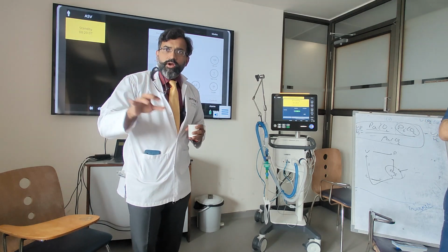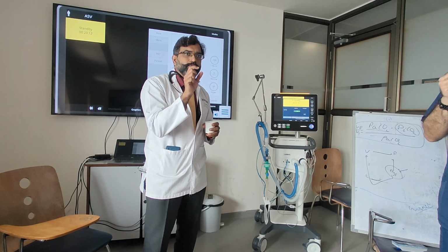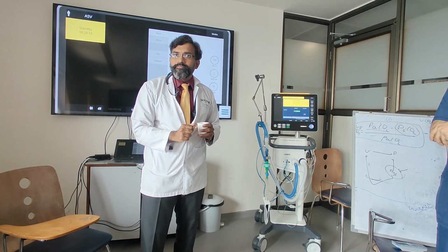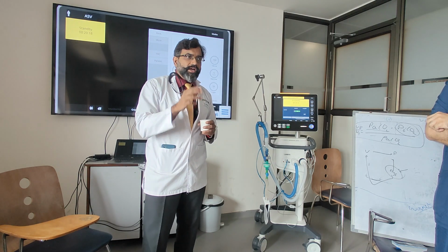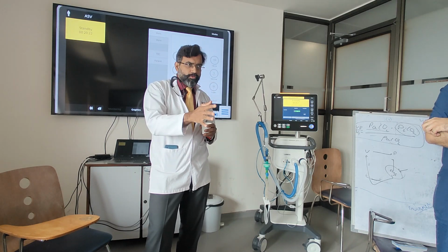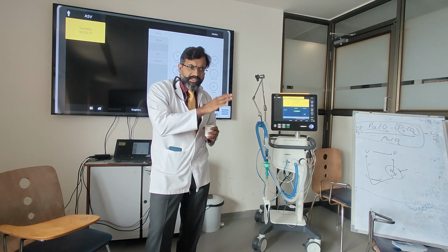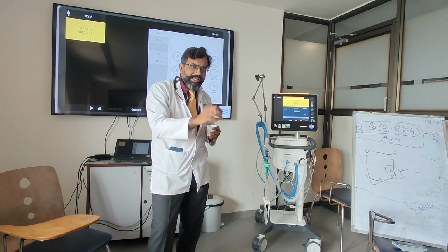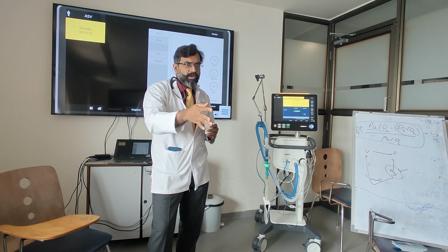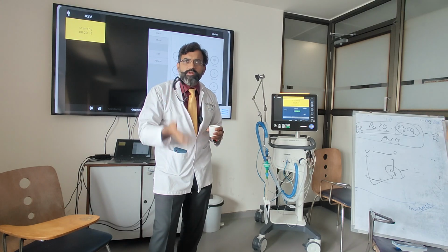Why I am telling all of you is that the patient will move from very sick to less sick, and you may not change the minute volume. You will see a ventilator to ventilator difference. So I think on the first day you should still use your conventional mode, maybe CMV or something like that. Let the resuscitation get over. Let the patient get less sick. Then you go to an ASV mode. Otherwise, you will have alarms ringing, RR being fast, adrenaline being haywire. You don't understand really what's happening.